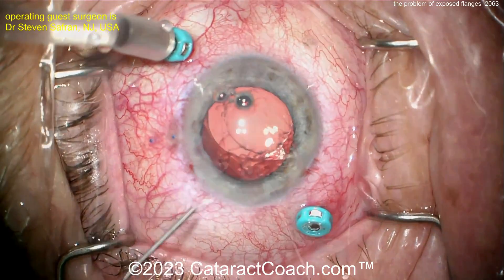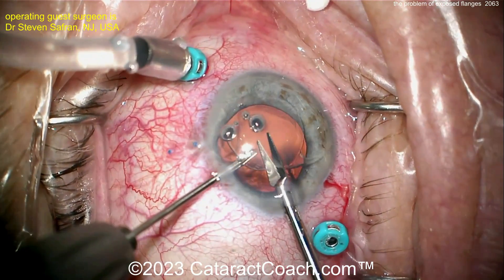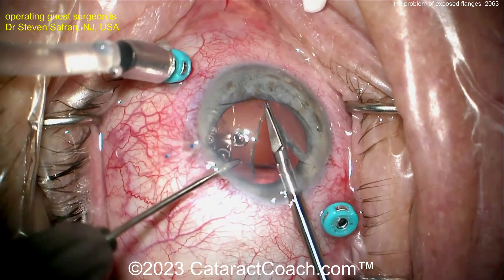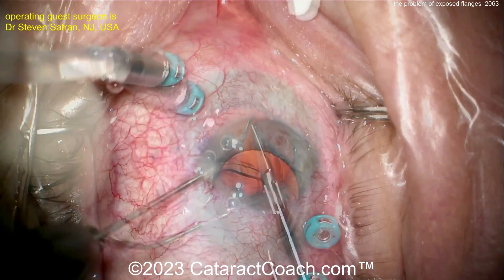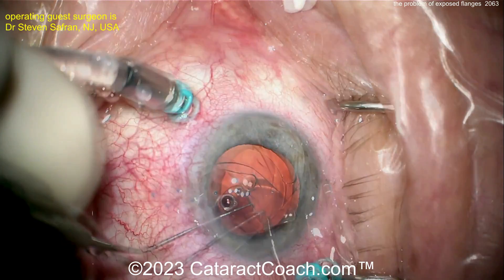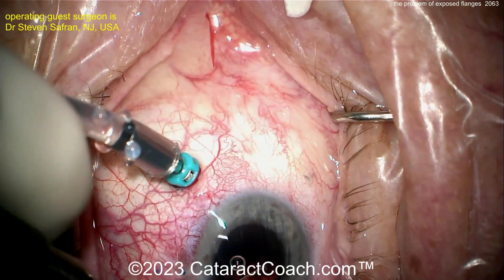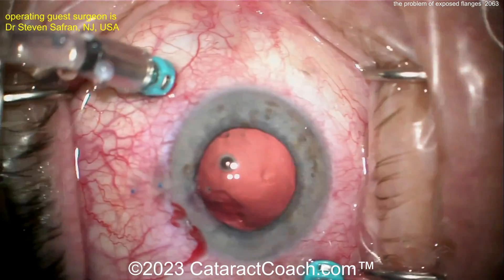So here's getting the lens up, putting some viscoelastic to protect the cornea. He's going to cut it in half — could also do the twist-and-out technique. Taking this lens outside the eye, and you can see as the pieces are coming out, that flange there was very loose. It really wasn't holding that lens haptic very well.